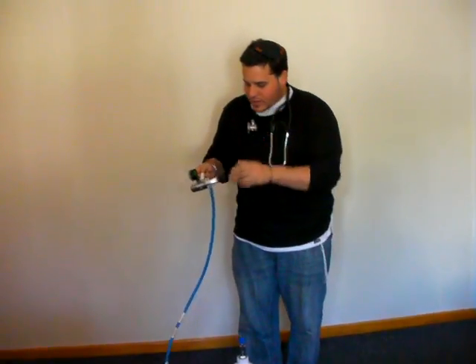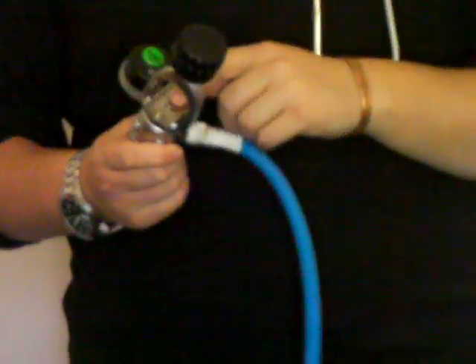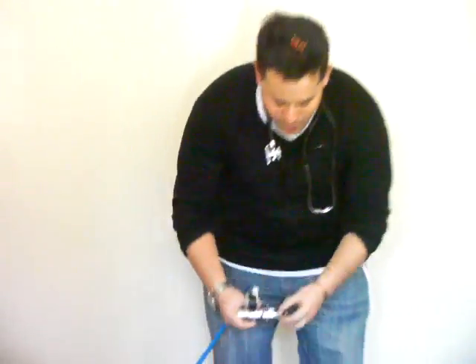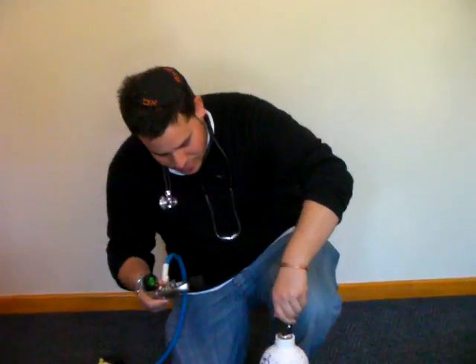Make sure that you have the right regulator by checking that there's one dot. Checking for the Bodok seal. Apply the regulator correctly.